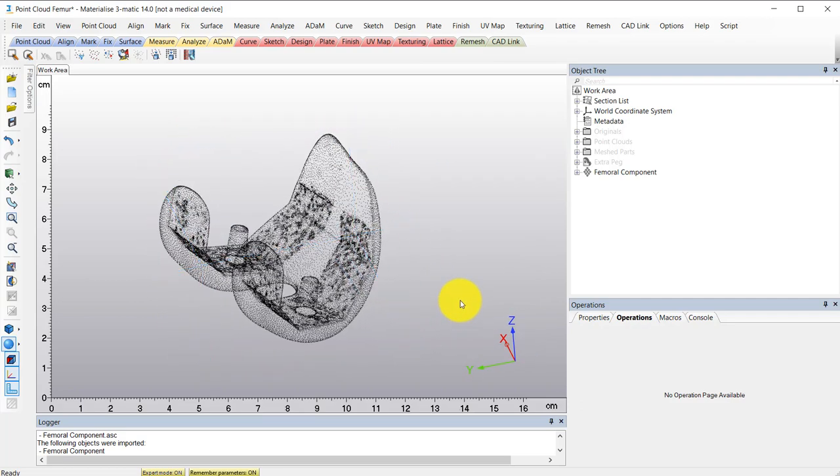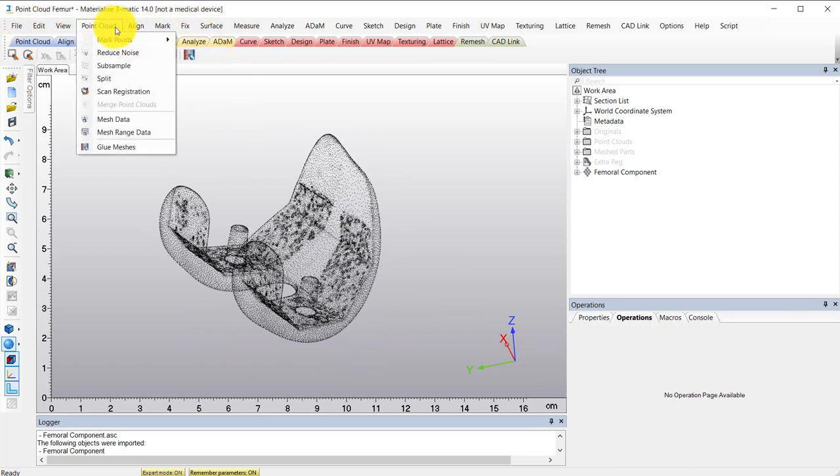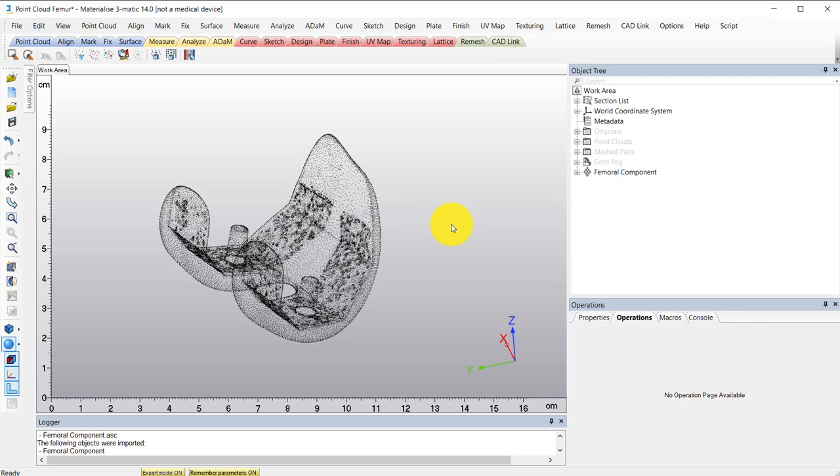Keep in mind, I'm using 3MATIC and I'm in the research version of the software. The point cloud module is only available in the research version. So make sure you see this message here to know you're in the research version of 3MATIC.